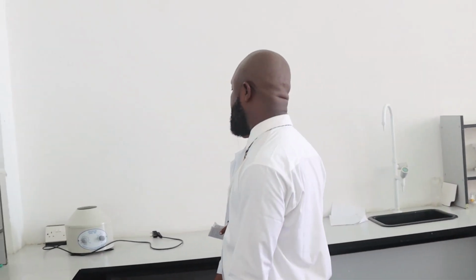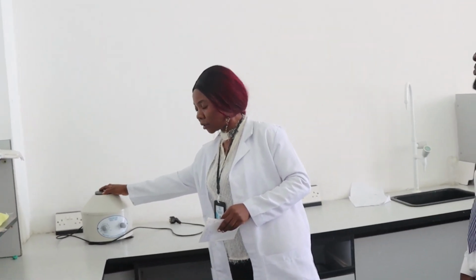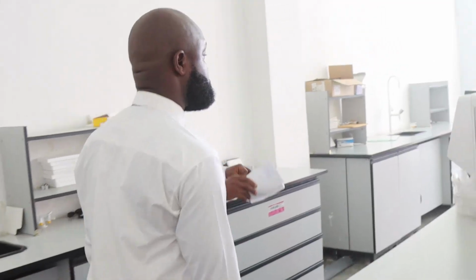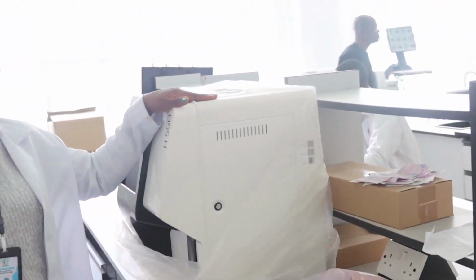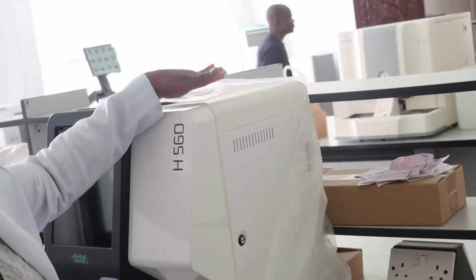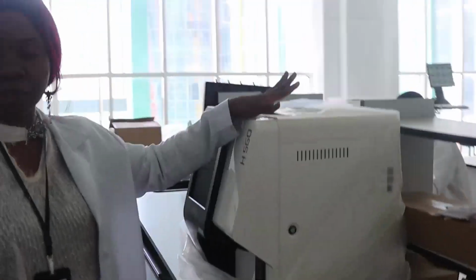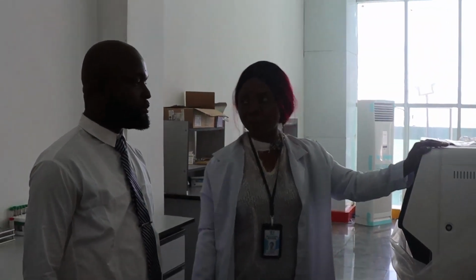Do you have another alternative equipment or machine that you can use in place of this one? Like I said, there are so many different types of centrifuge, because a centrifuge is a centrifuge. And then this is our hematology analyzer for full blood counts. We have two or three of them here, all for full blood count, to differentiate the white cell, the red cell, and to know their amount in the system.